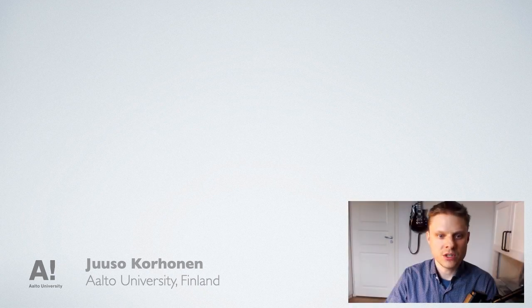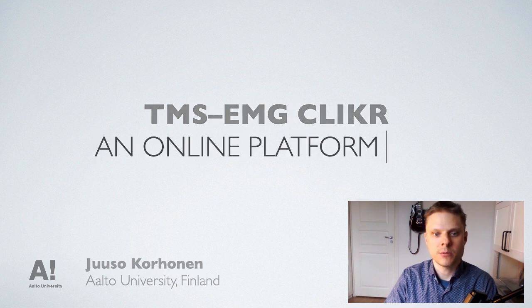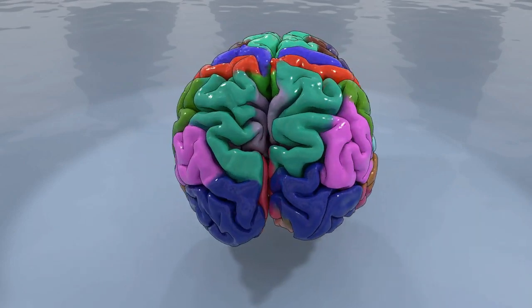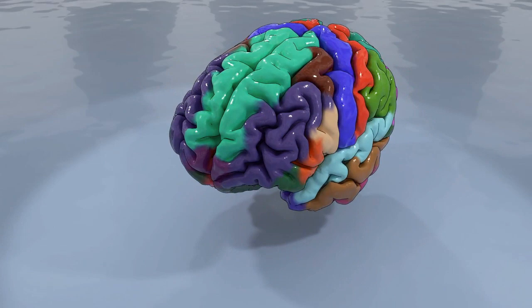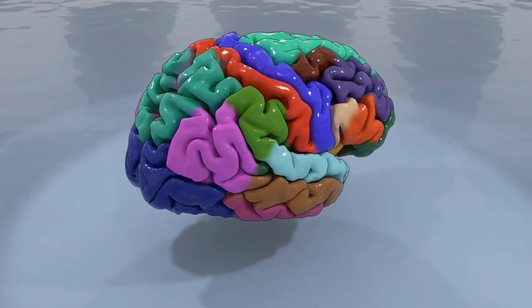I will present you something we call the TMS EMG Clikr, an online platform for physiological data annotation. In order to understand what the platform is and what are the specific challenges we help to overcome, let us look at the typical TMS EMG experimental setup.